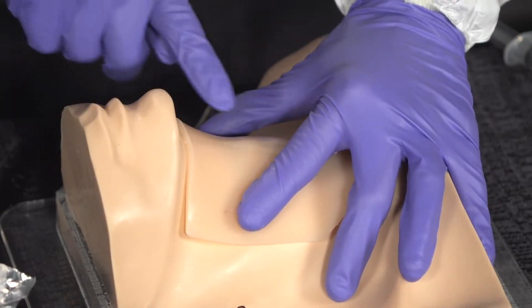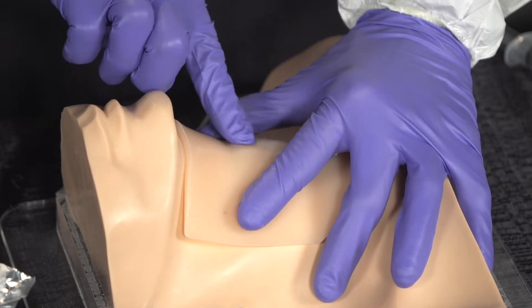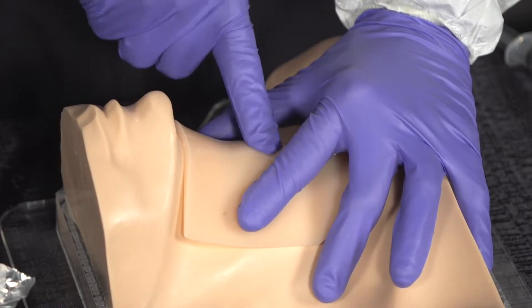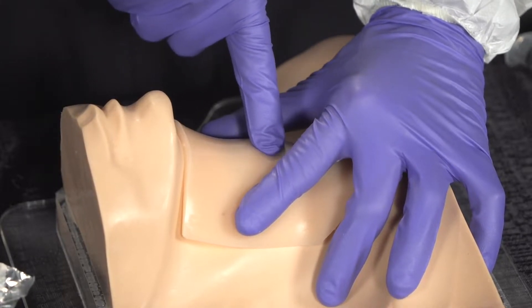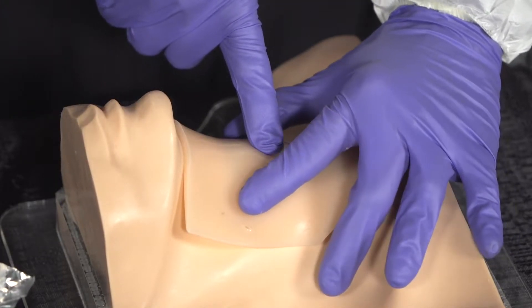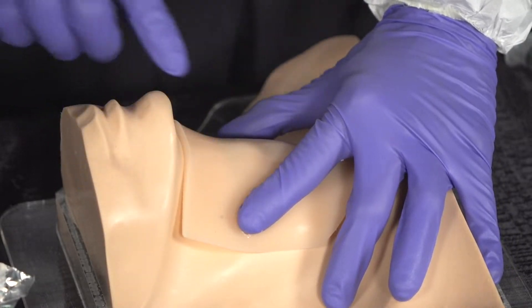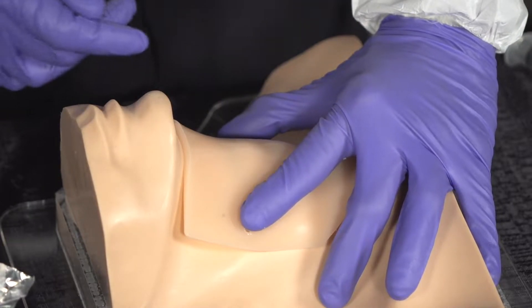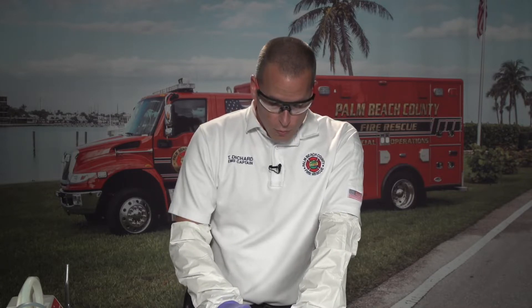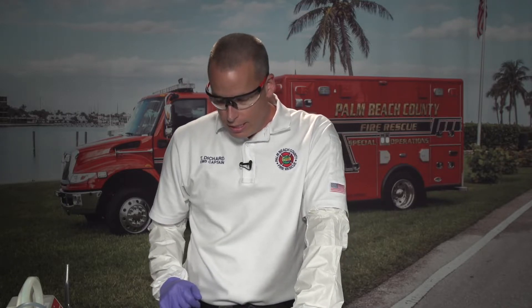The landmarks commonly taught are hill, valley, hill in the center of the throat. Our goal is to cut the cricothyroid membrane, which is in the valley between the two hills. Once landmarks are noted, hold the skin taut to prevent missed cuts, then sterilize the skin with alcohol swabs or betadine solution. After that, do not touch the site and contaminate it further.